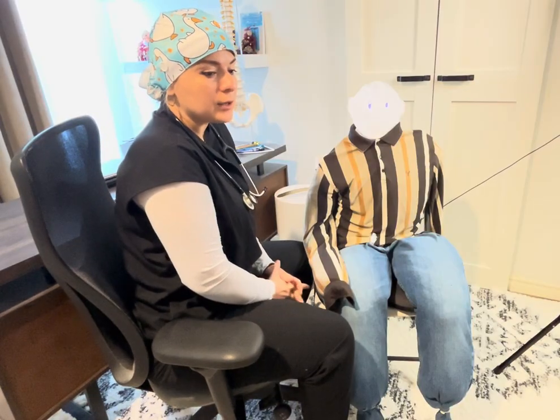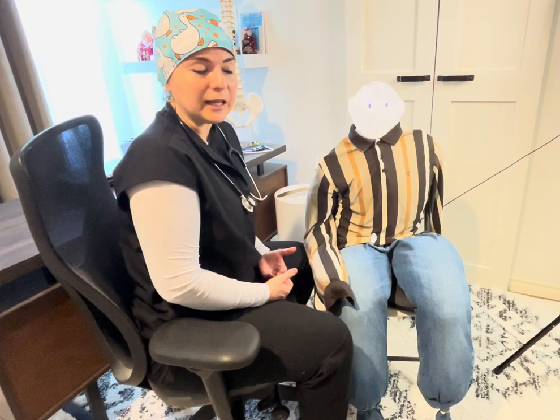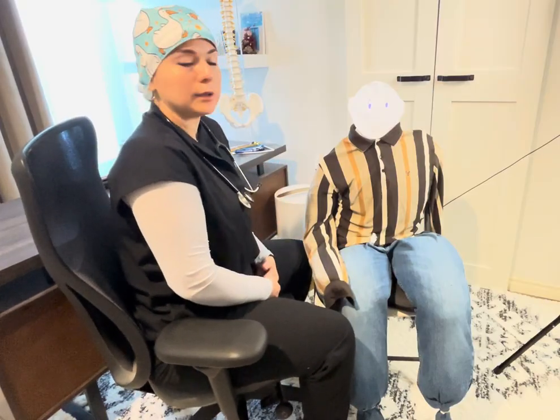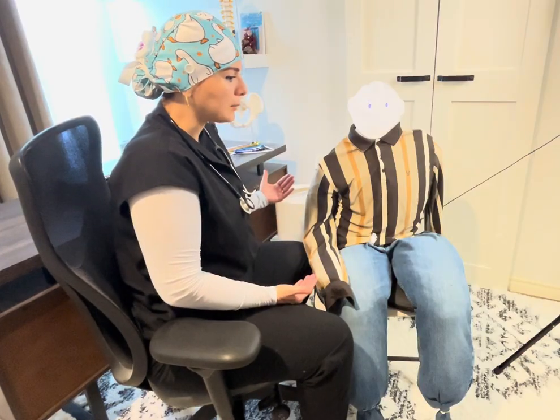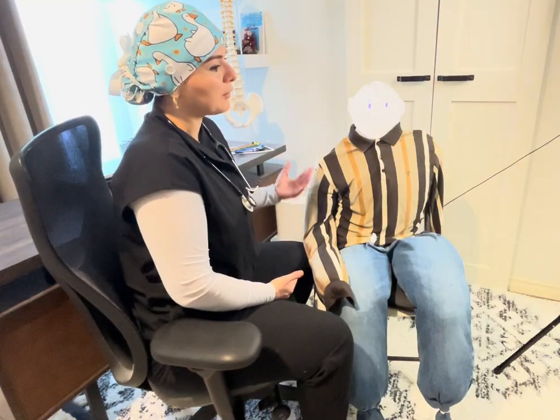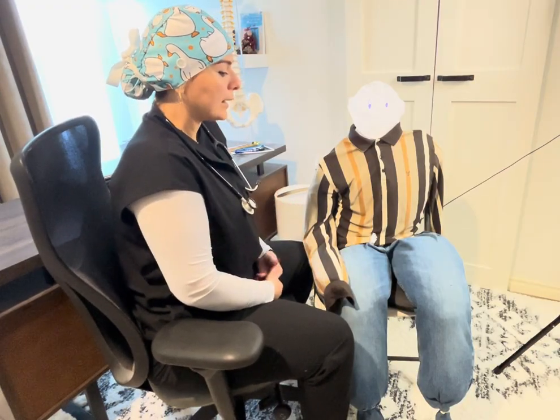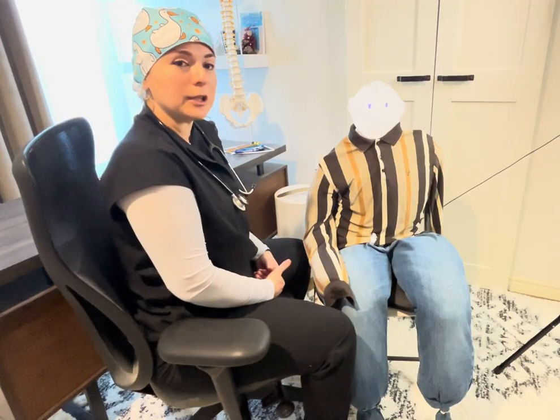In order to do that, we need to make sure we have everything we need: the stethoscope, the blood pressure cuff, and proper patient positioning. We need to make sure the patient is comfortable, either in a supine position with the head of the bed elevated or in a sitting position. As you can see, I have my patient in a sitting position.